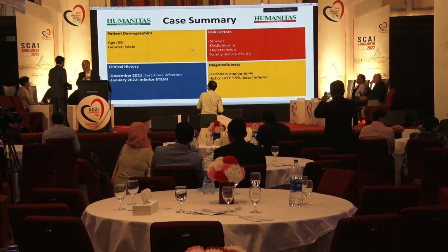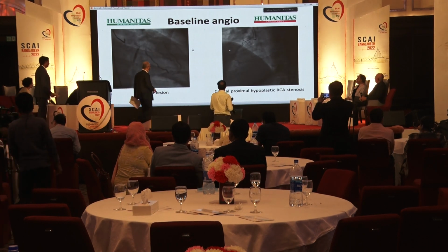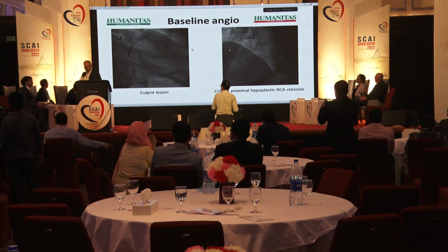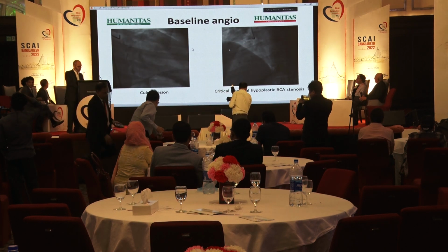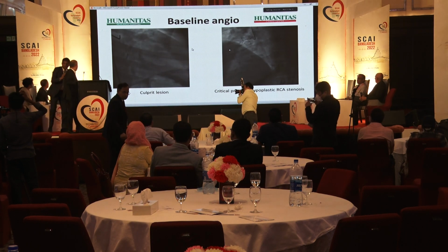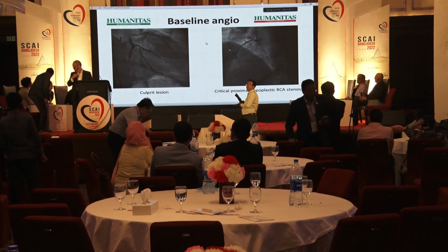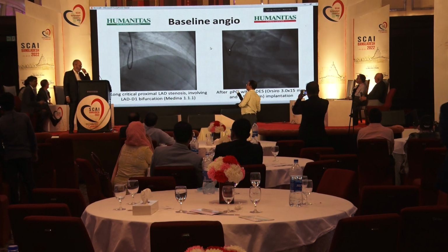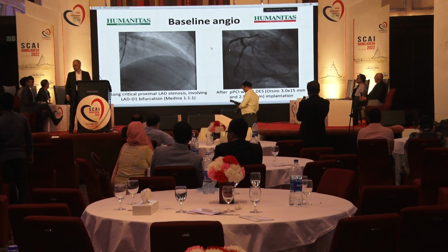Let's see the next slide, where we can see the presentation. He had an occluded dominant left circumflex that we treated with stents, and then we did also the revascularization of the marginal and even of the small RCA, because we wanted to save this LAD for you. So let's move to the LAD. Next slide. And we can see here the long LAD lesion, probably with some involvement even of the distal left main and proximal LAD that we will evaluate with imaging today.